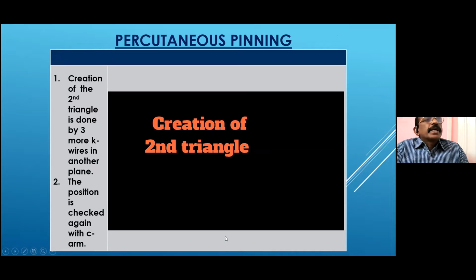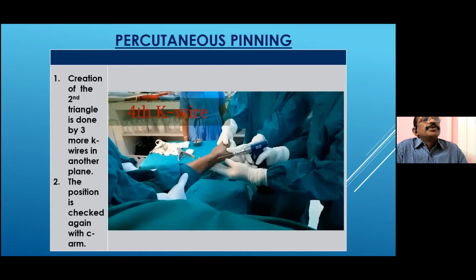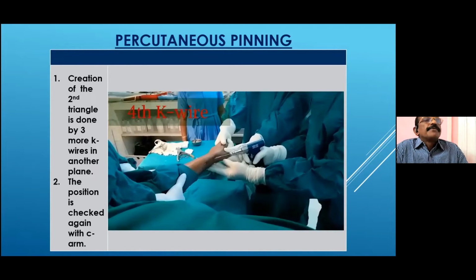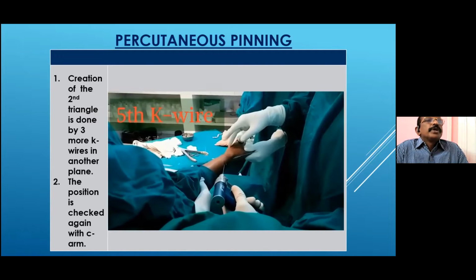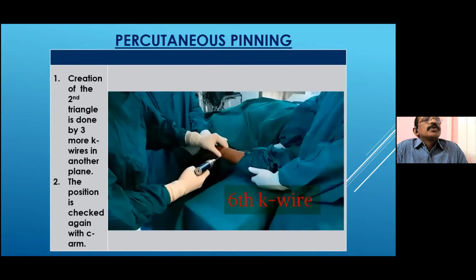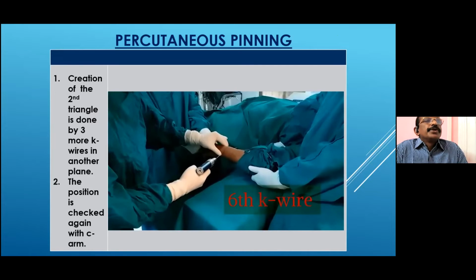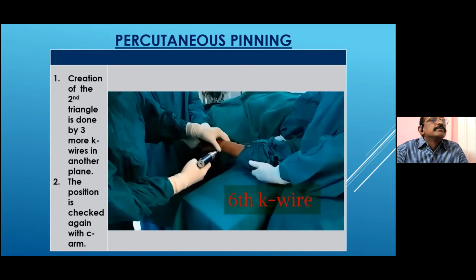The creation of the second triangle is also in the same direction, but in a slightly different plane. That is from the radial styloid towards the proximal fragment, the fourth wire. The fifth wire is from the proximal fragment towards the lunate fossa at a slightly different angle and also in a different plane. And the sixth wire is from the ulnar head towards the radial styloid, which is also in a different plane.